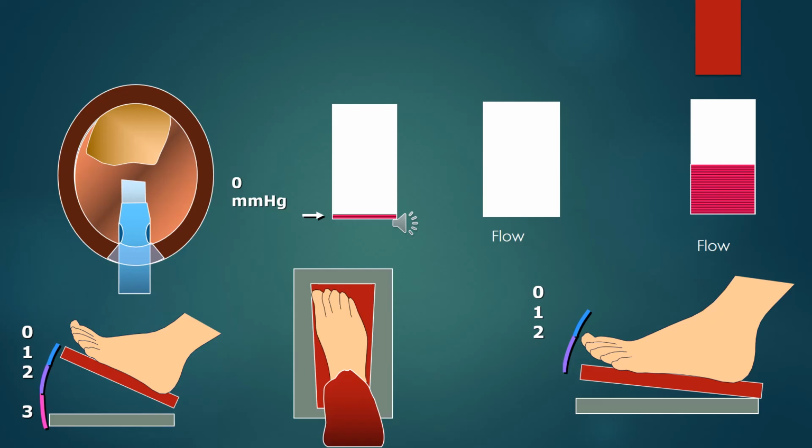When there's no flow, what happens inside the tubing? It has to generate vacuum then, because you have got rid of the fluid in the tubing, which is attached to the phaco tip. When the pump draws the fluid and gets rid of whatever residual fluid is there in the tubing, it has to generate a vacuum because you have occluded the tip, yet the pump is rotating. So the vacuum will be generated inside the phaco tip, inside the tubing, till the cassette level.